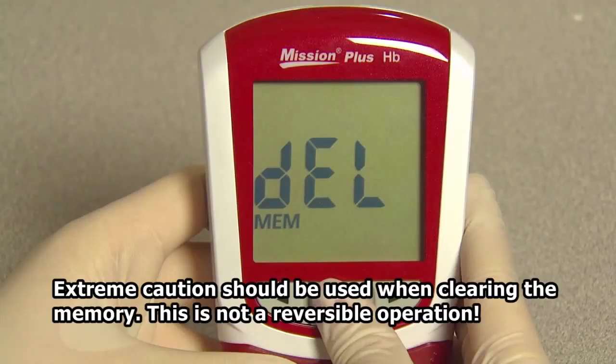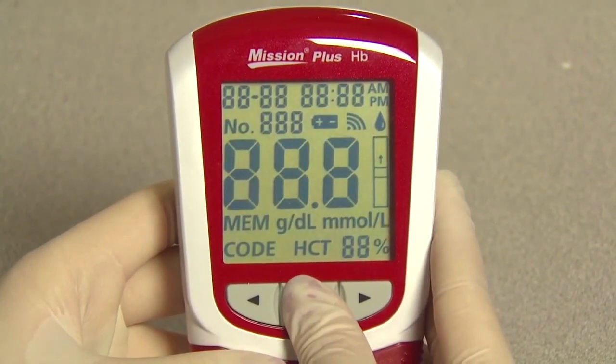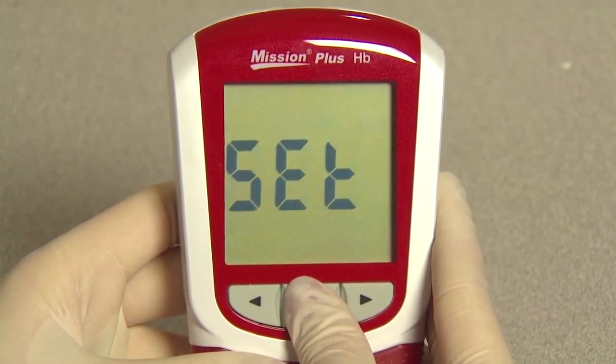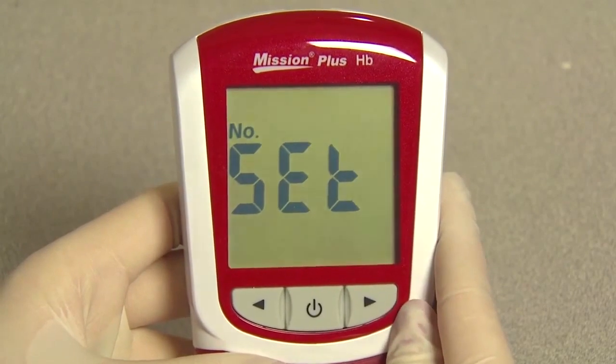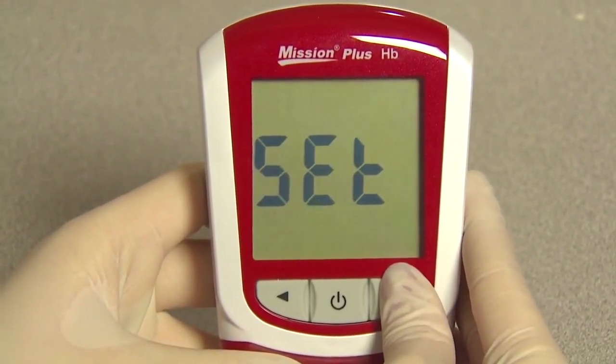Clearing the memory. Extreme caution should be used when clearing the memory. This is not a reversible operation. To delete all data from the meter database, press and hold the power button to enter the setup menu. Press right or left until DEL is displayed.